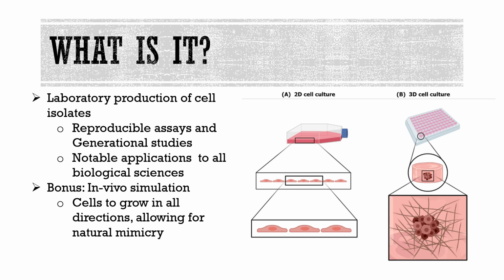The problem with 2D cell cultures, however, is that they are not representative of the cell's true environment. The monolayer or flat surface model causes changes in cell activity that are inconsistent with how the cell would function under natural conditions. This becomes an issue in fields such as oncology and human tissue repair, where accurate predictability is essential for success. On top of that, 2D modeling is at a higher risk for things like cell death and nutrient depletion resulting from waste secreted by neighboring cells.